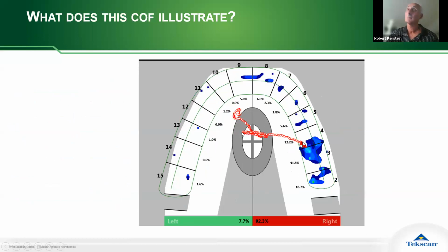And then when she actually moves to the right, the center of force, instead of going to the canine, goes to the first molar area, which is taking up 50% of the excursion. Right? So here you can see there's less teeth on this side. You know she's moving to the right, but the center of force is going towards the posterior teeth. This is a backward COF. You never want to see that either. That and the looping ones are the worst ones.